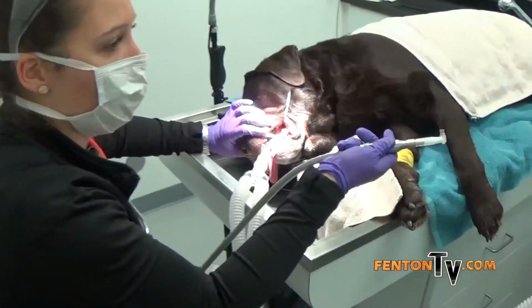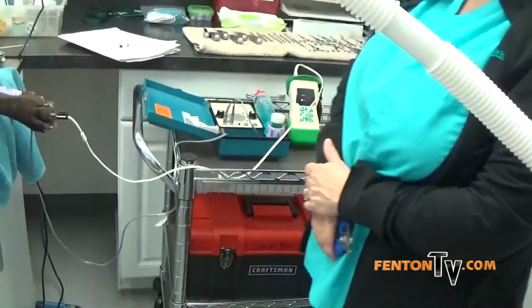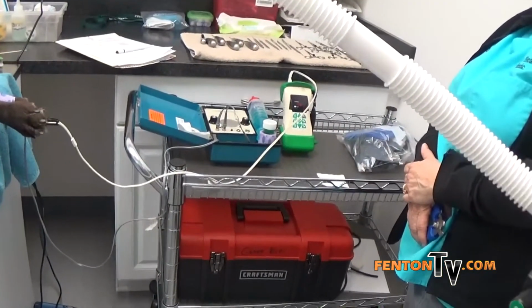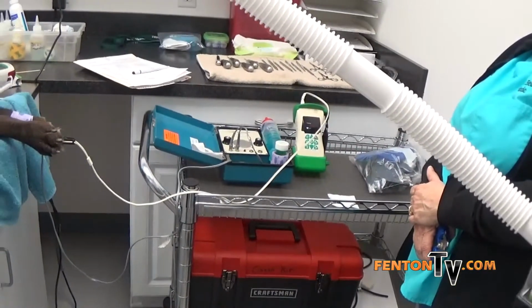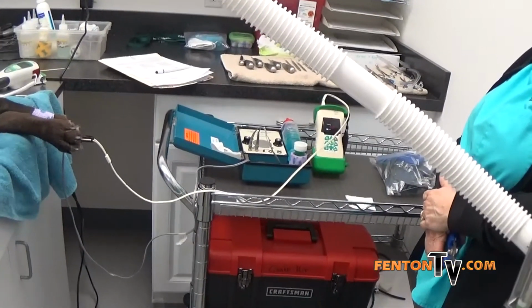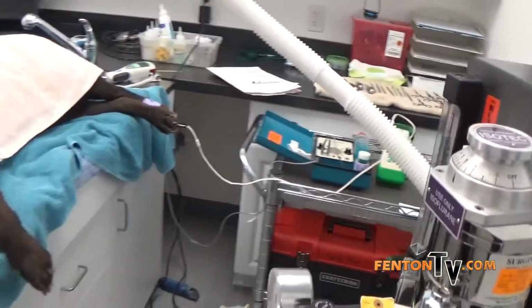And I'm listening to the heart rate and the pulse ox as well. And that sound we're hearing is the blood moving through his body. Yep, that's picking up on the blood movement in his heartbeat. Excellent.